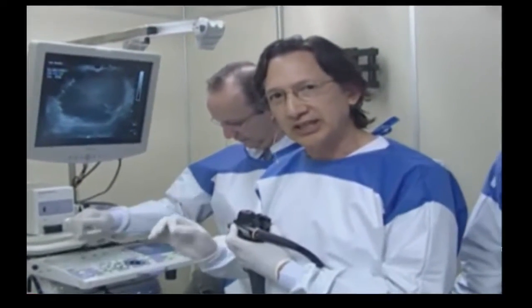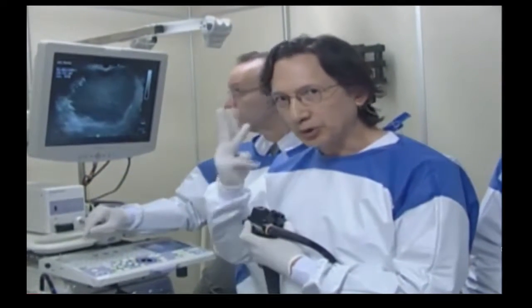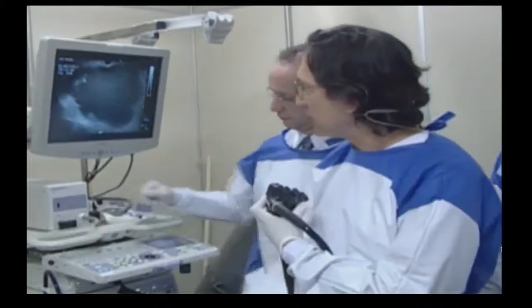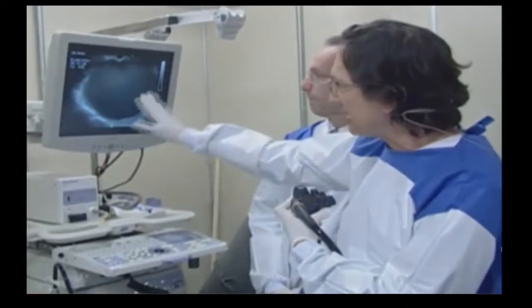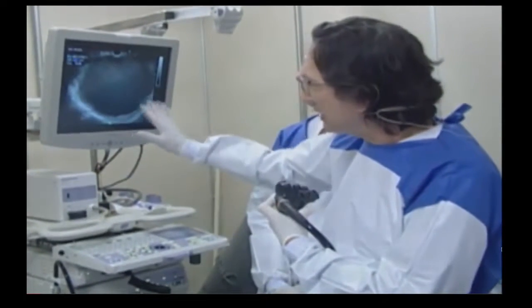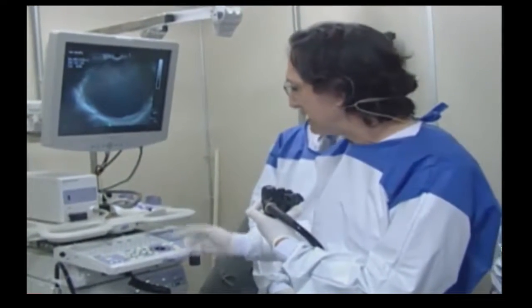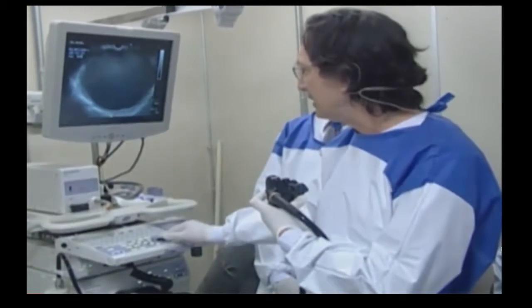So, we're going to show pseudocyst drainage. This is a very nice case. The first thing you need to determine is whether the cyst is a good candidate for endoscopic drainage. There are 3 things you want to look at. The first is the contents of the cyst. You can see that the contents here look mainly liquid. It's a ground glass appearance, so I think the liquid is rather thick. It could even be infected, but it does look like it's mainly liquid.